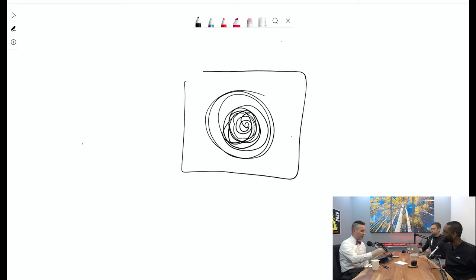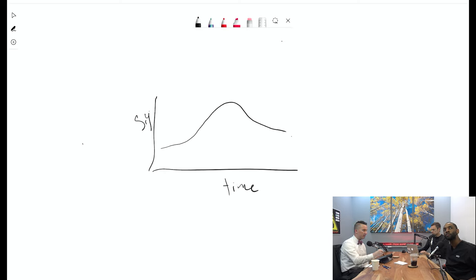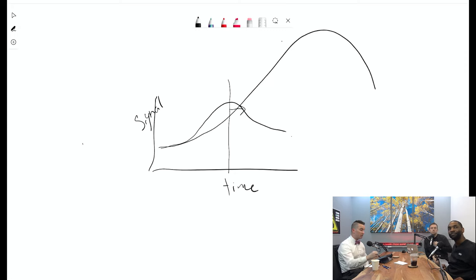But the problem with that, just super quick, is that you're measuring signal here, right? So this is time, and this is signal. A lot of times you'll see people go to the peak and then add 3 seconds or something. Do you guys ever do that? Oh, yeah. Well, this is the peak if there were just 1 cc of contrast. If I really gave the true big bolus, my contrast bolus would be here. And so that's not perfectly perfect either.